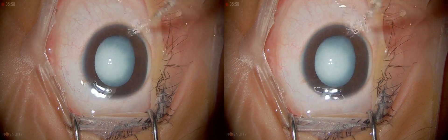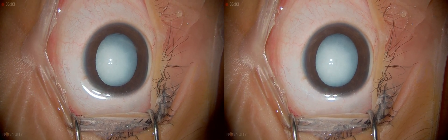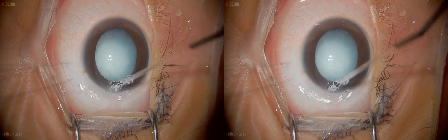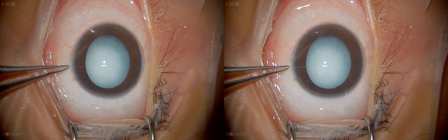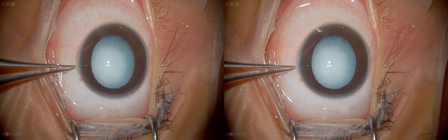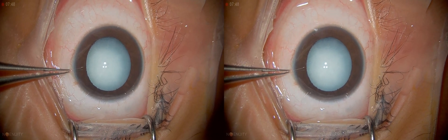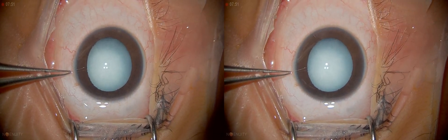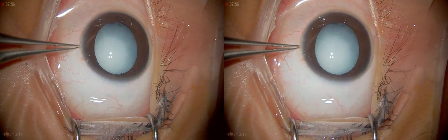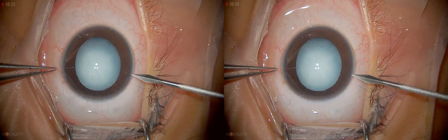This is a case of a four-year-old boy who had a history of whitish reflex in both eyes since two months. That's a little bit atypical feature about this patient. The lens is a bit swollen — sometimes you can get that. One clue to differentiate between posterior lenticonus and intumescent lens: the anterior capsule will be completely flat in posterior lenticonus because the lens goes behind. Looking here, it looks a little bit swollen, so chances of posterior lenticonus are less.